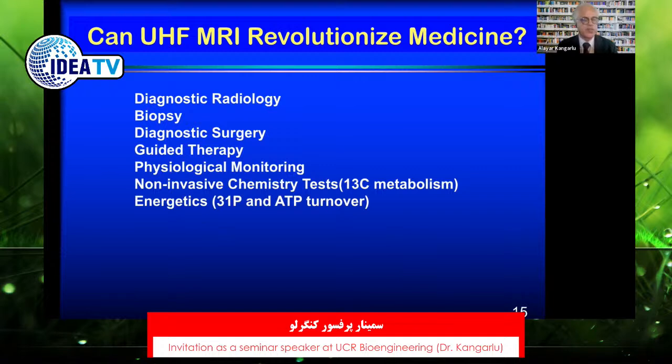They are not structural scanners, and the space, the vacuum for a diagnostic imaging tool with very good gray matter, white matter contrast, with biological tissue contrast, was really felt at the time, and MRI filled that void. So the soft tissue contrast in MRI is really second to none. It's unmatched by any other imaging modality.